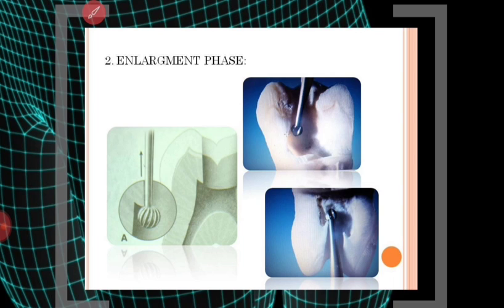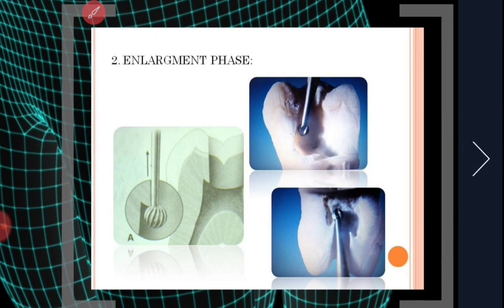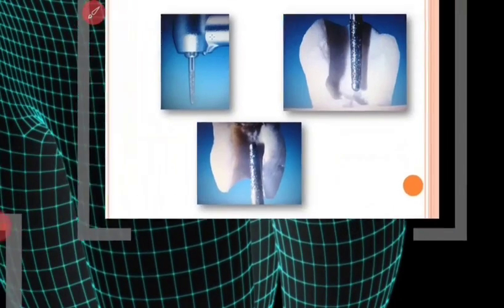And once you are there, you can always give an intrapulpal, though it is very painful. If you can use the X-tips, intraosseous, LA or other forms of local anesthesia, go for that. But as a last resort, if nothing is working out, use a fresh carbide burr, find the pulp horn opening, and give your intrapulpal. Do warn the patient. So this is the second phase.